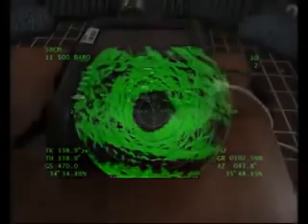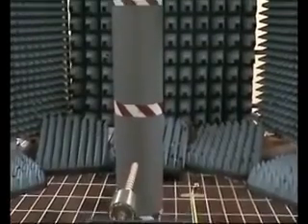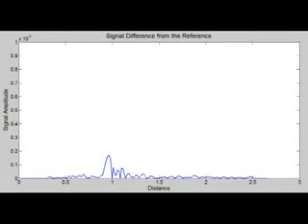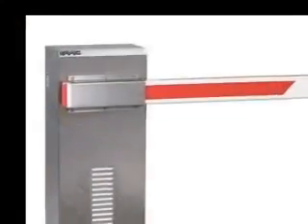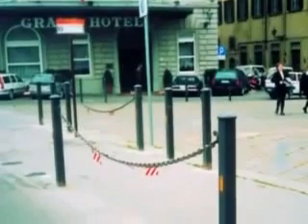The main difference between the device proposed and a common radar used, for example, to survey airspace is that the possible obstacle and the radar antenna are very close. The distance, in fact, is about a few meters. Moreover, the obstacles are very different in shape, material and position, and in some cases the traditional white stick, the aid blind people most frequently use, is not able to detect their presence.